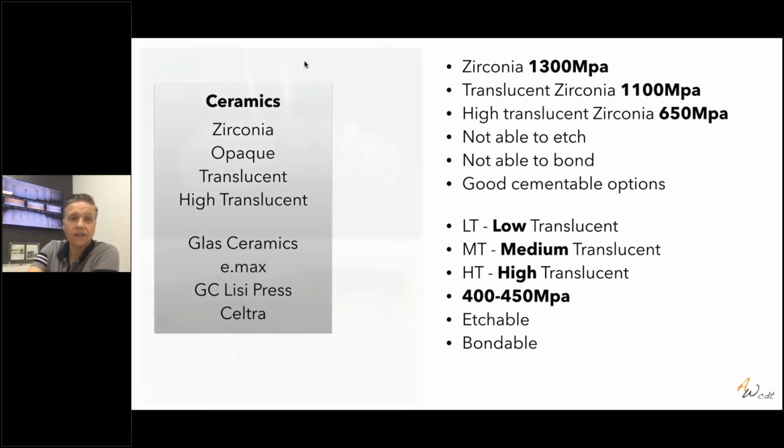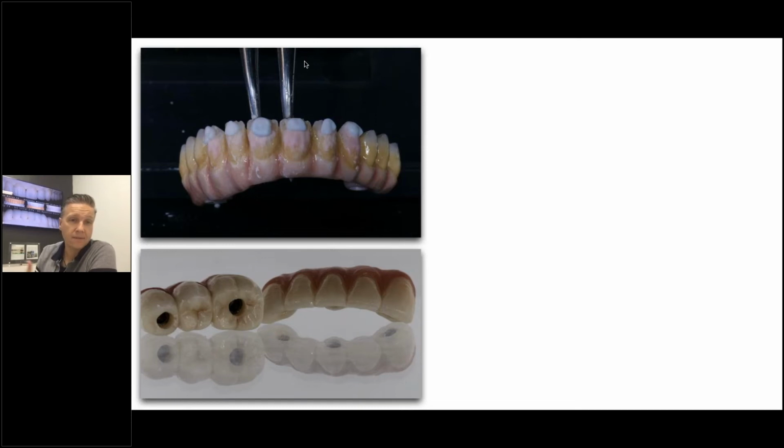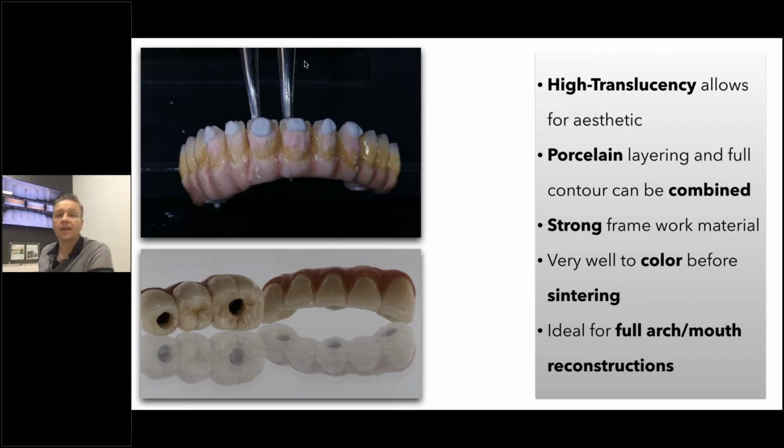Just to point out, the HT Plus, for example, is utilized in my laboratory for almost everything, from single crown restorations up to full mouth rehabs. You see here an example of a zirconia hybrid, which is basically full contour in the posterior area. I always layer my full zirconia hybrids in the anterior area just to give it a little bit of kick, and that definitely pays back. The advantage is I have a very, very strong framework, over 1200 megapascal, which is definitely enough for a full arch or full mouth rehab, but I still have a nice translucency for a very natural look.